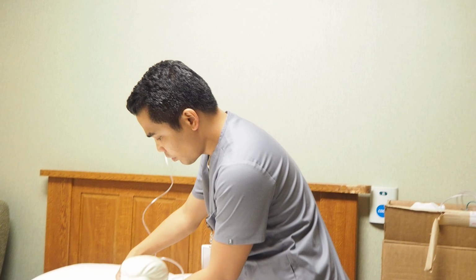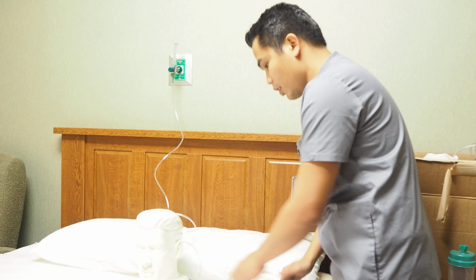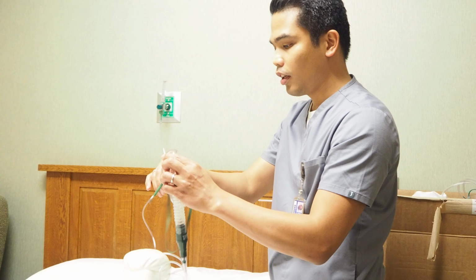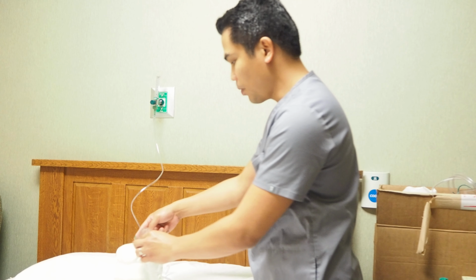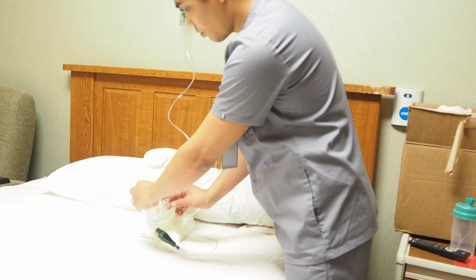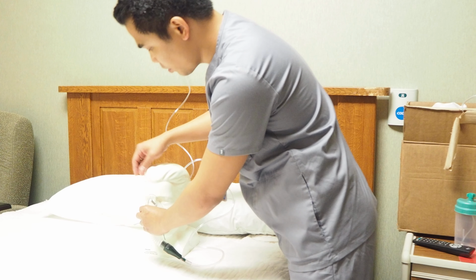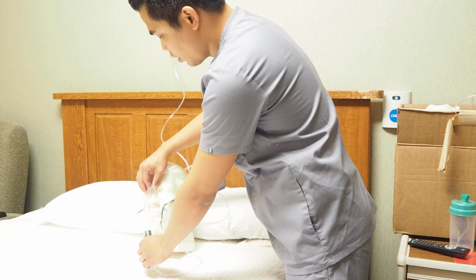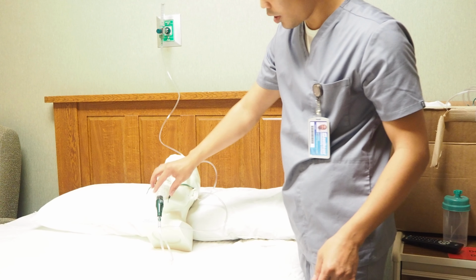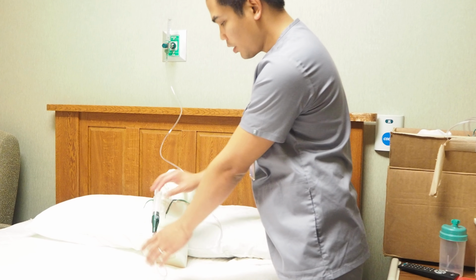Make sure we feel with our hands that there's air coming out, and then we try to loosen this one a bit. Regardless of the patient's condition, be it conscious or lethargic, we still explain to the patient that we're going to change to a new device for them to receive more oxygen. Make sure we reposition it, that it is not kinked, with no obstructions or any blankets covering it.